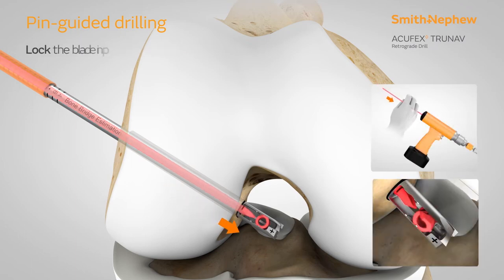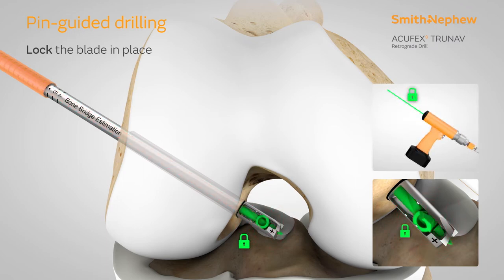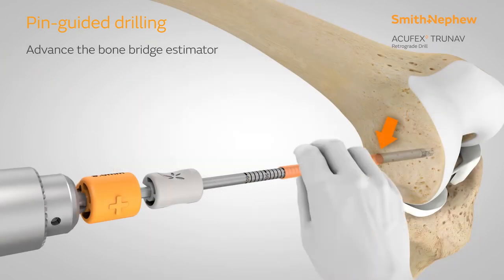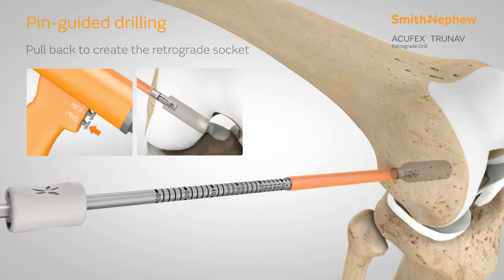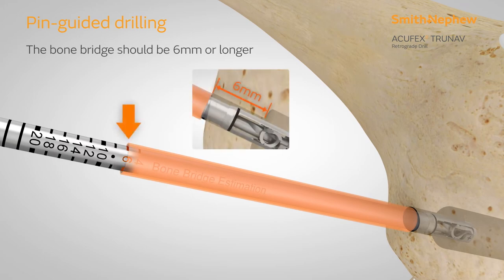Lock the blade in place by advancing the guide wire until a hard stop. Advance the orange bone bridge estimation tube against the cortical wall of the femur. Create the retrograde socket by slowly pulling the drill back and stopping once the desired bone bridge is achieved. The minimum recommended bone bridge for ultra-button is 6mm.